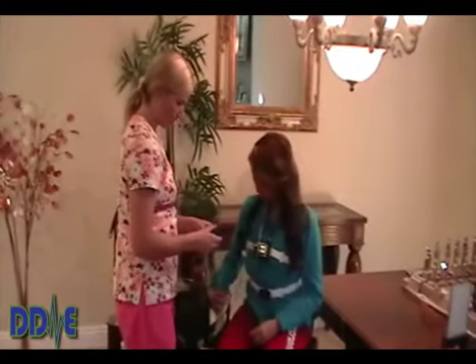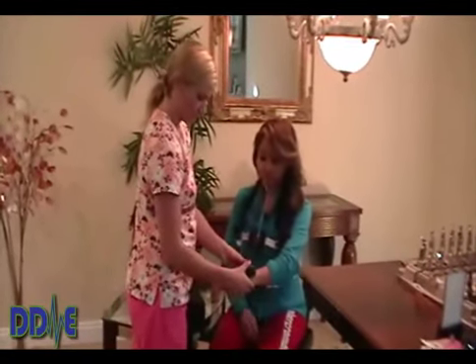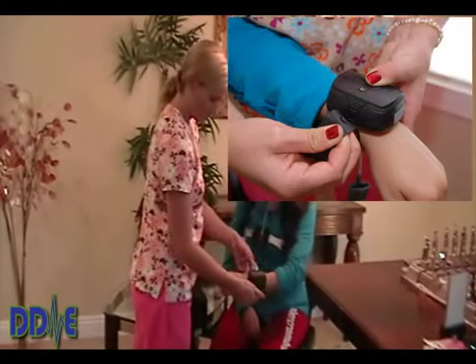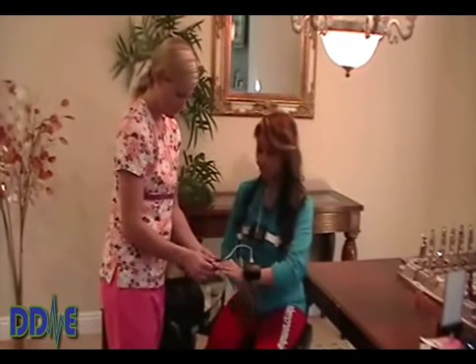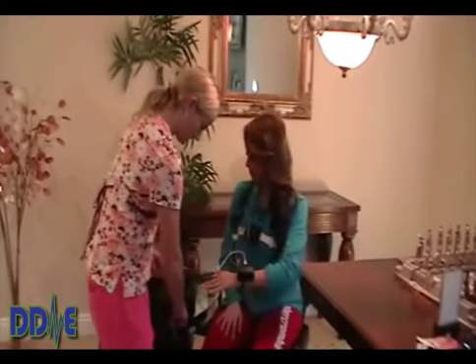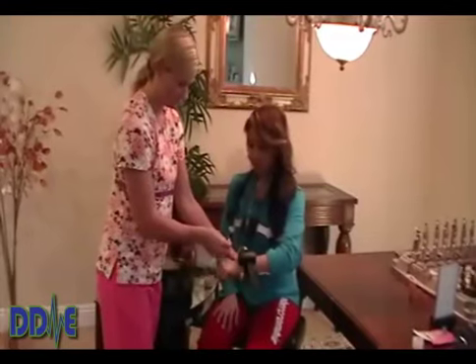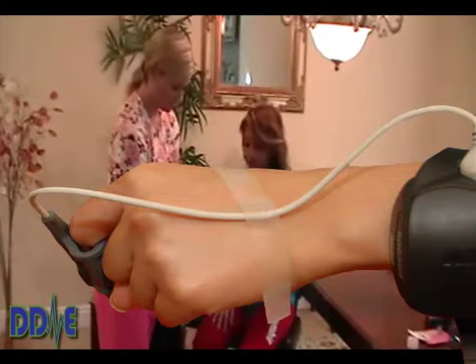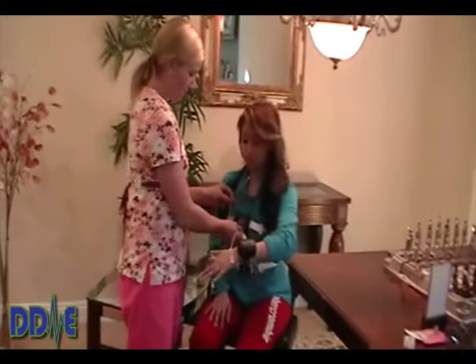We recommend giving instruction and actually putting the wrist oximeter on the wrist. Wrap the rubber strap around and click the hook. When putting the finger probe on, make sure the patient understands they can move that probe around just a little bit if it gets uncomfortable during the night. We also recommend putting a piece of tape across the back of the hand to help secure the finger probe, as oximetry is probably the most important single channel that we record.